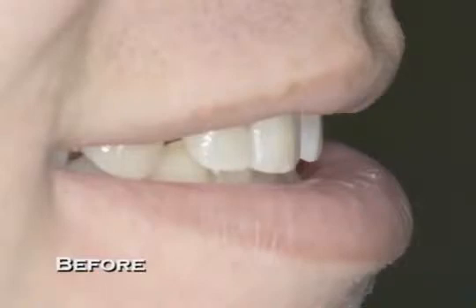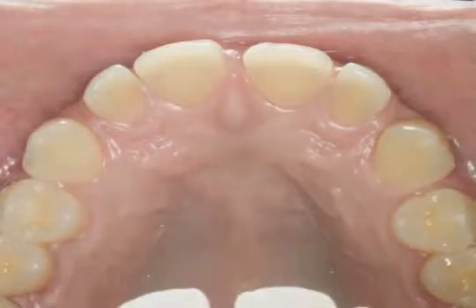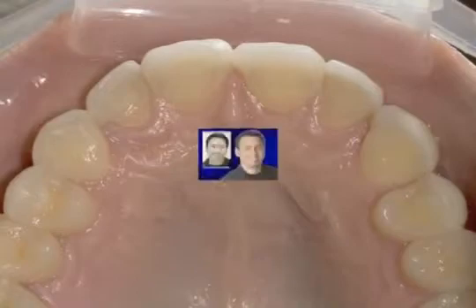And what we mean by facial limiting factors is teeth that are sticking out towards the facial. We know that when we do a technique like this with the ThinPress veneers, they can be pressed as thin as 0.3 millimeters. But if a tooth is already too far out to the facial, adding another 0.3 millimeters to it is not going to solve any problems. In Chris's case, none of his teeth were inclined out to the facial, and that was another good indication for using no-prep veneers.